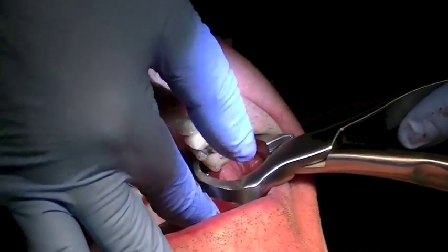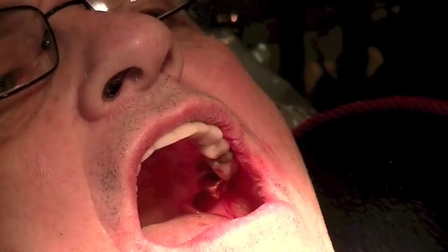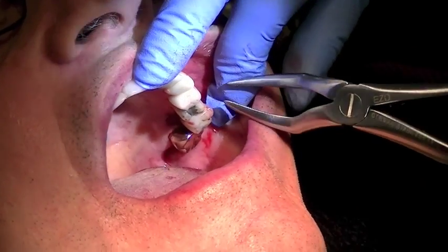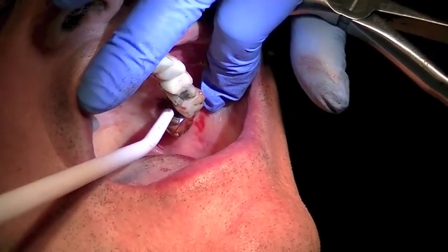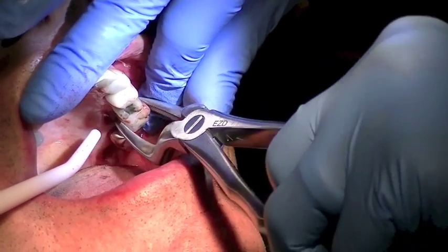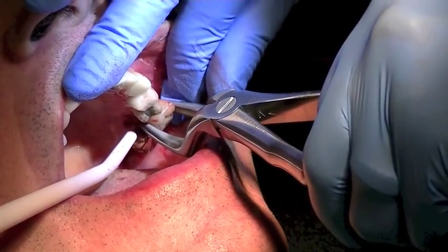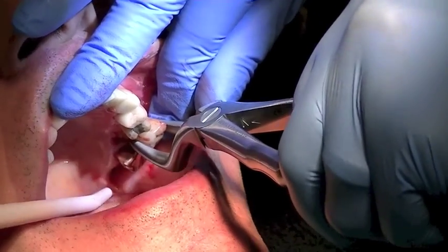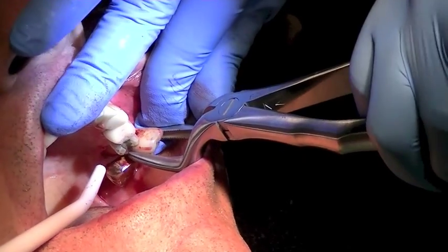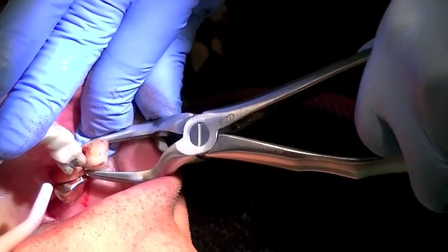So now I'm going to stop and use a delivery instrument. Although it looks like the tooth came out to the cheek or to the buccal, really the tooth was being elevated out of the socket. So now I can take this delivery instrument and complete my extraction.